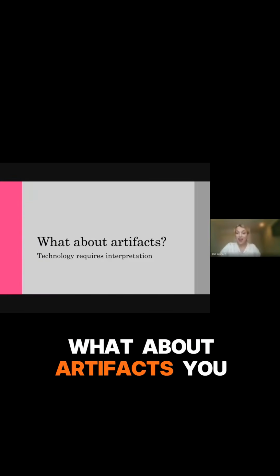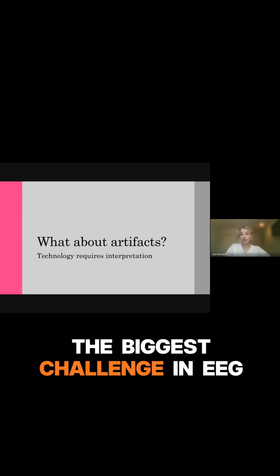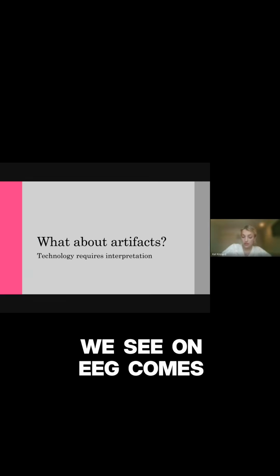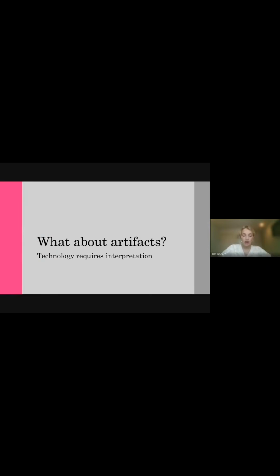What about artifacts? You know, technology requires interpretation. The biggest challenge in EEG are artifacts. So not every wave we see on EEG comes from the brain. Artifacts are signals that come from any source other than your brain.